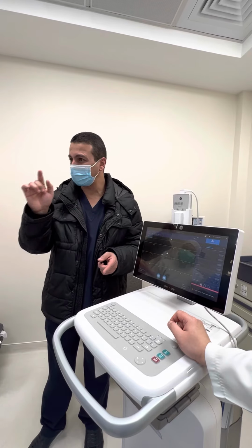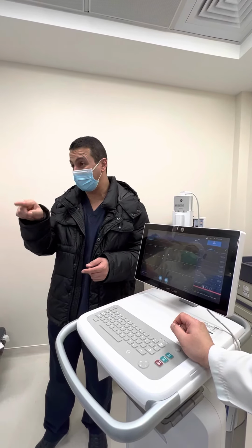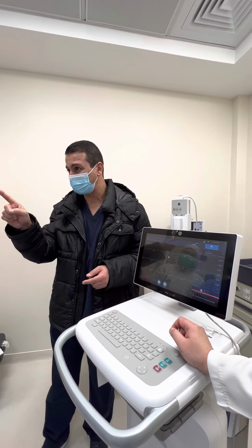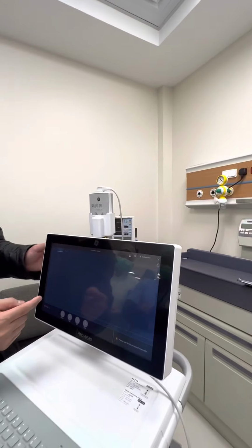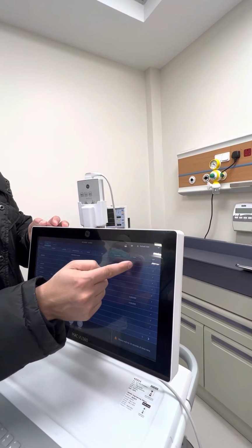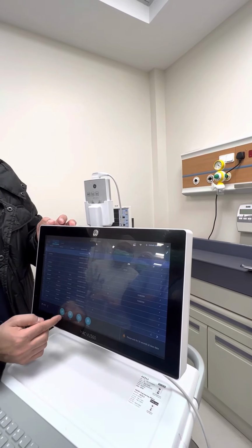Upon doing the transmit, you don't have to get back to the report from here. It's going to be auto-deleted after transmit. So when you decide to transmit one report, it's going to be auto-deleted. To check if it was transmitted or not, you will find it in the sent status here. So sent, it is checked. This report was not transmitted, so I can highlight this report and do transmit. Okay?